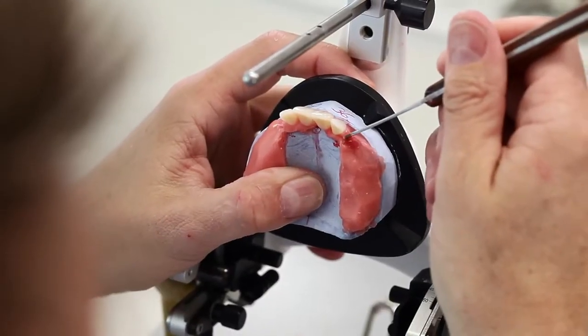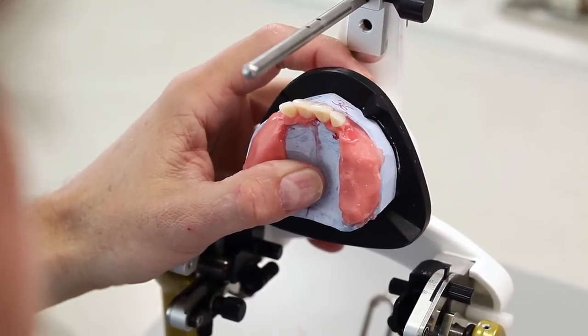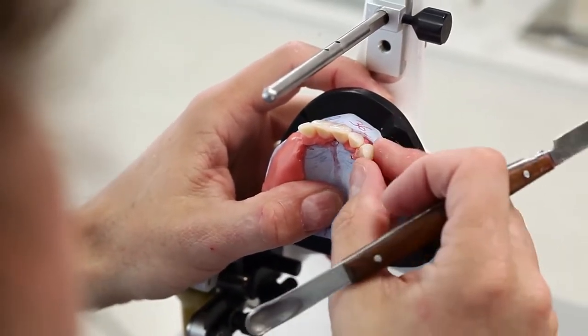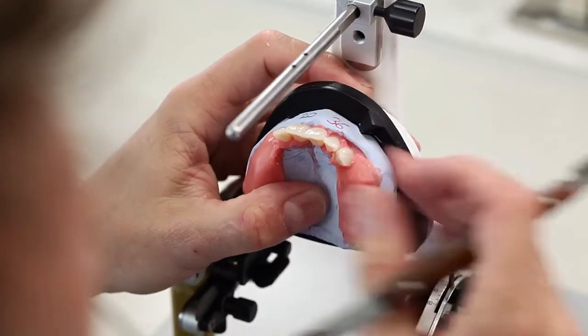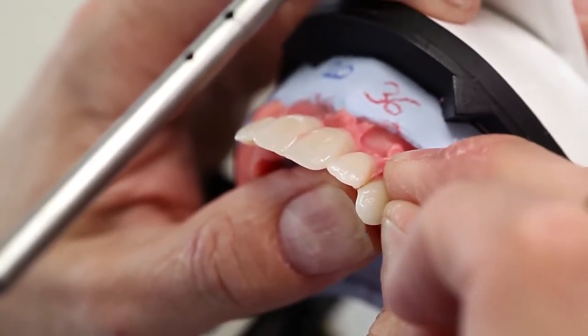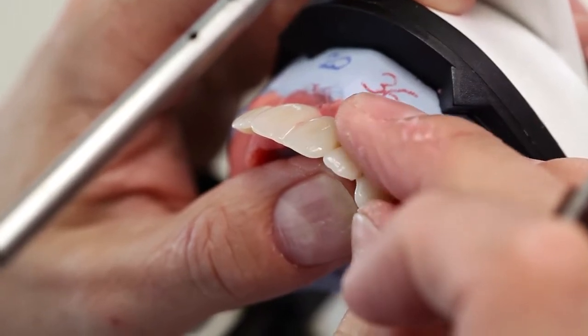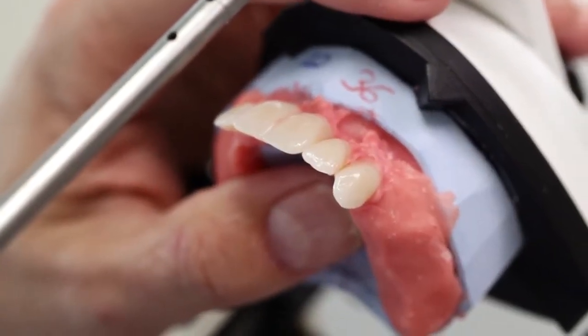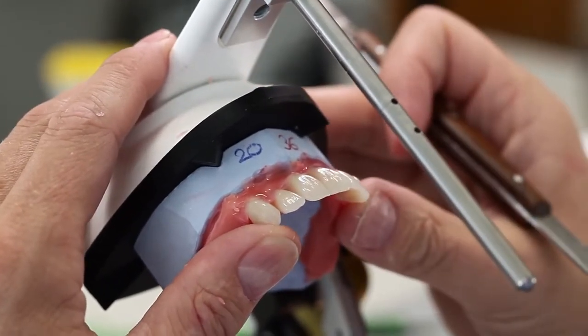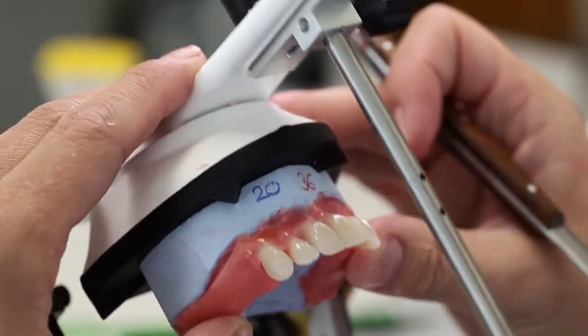The position of the canines is of decisive importance for the function and aesthetic appearance of the setup. The symmetric positioning of the canines, the most distinctive teeth in the maxillary anterior region, facilitates the setup. The canines are again set up perpendicular along the longitudinal axis. Ideally, the distal ridge runs parallel to the sagittal course of the alveolar ridge.